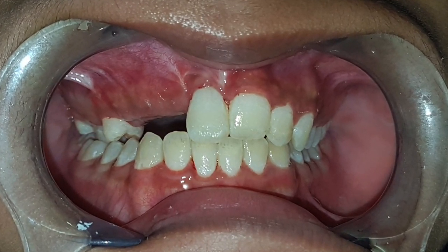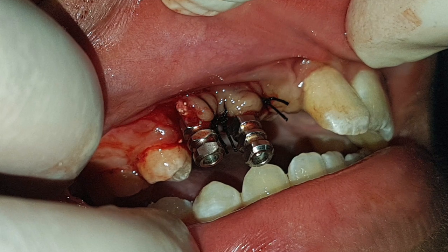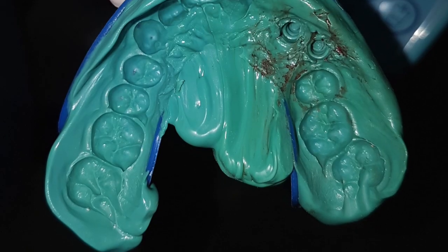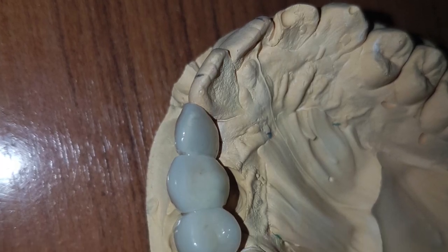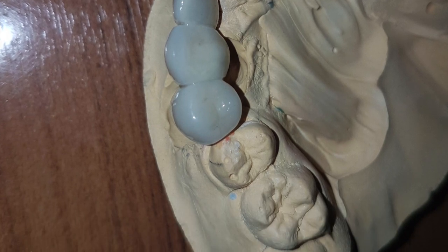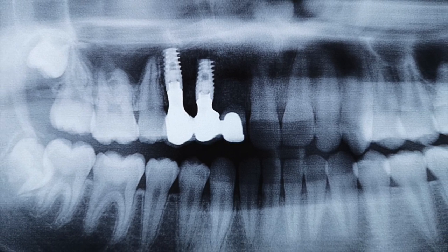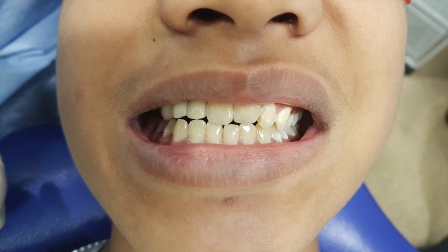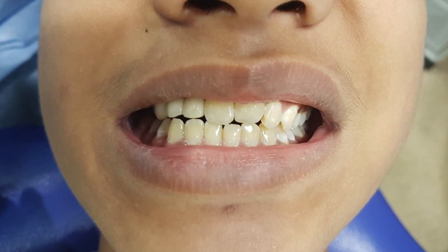We recalled the patient again after two weeks and performed the second stage. We found that a lot of the bone was quite positively healed, and then we took the impression. As you can see, the impression was taken properly, and within a week we had a bridge ready. We then inserted the bridge and took an OPG, and as you can see the patient now has wonderfully aesthetic teeth after four months of treatment.